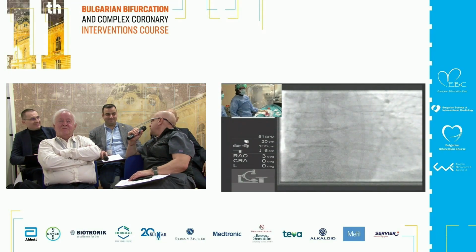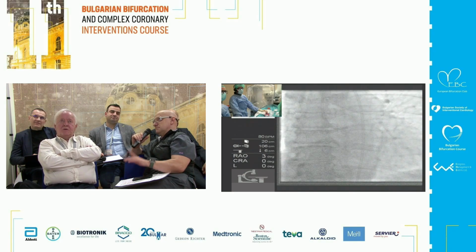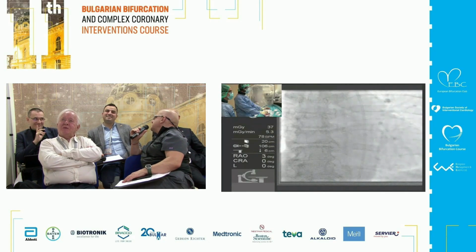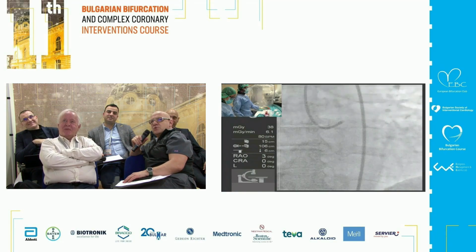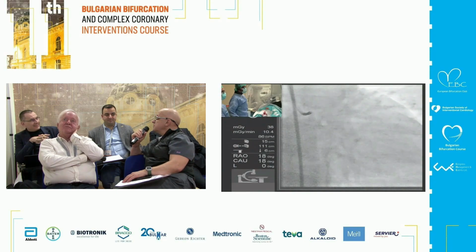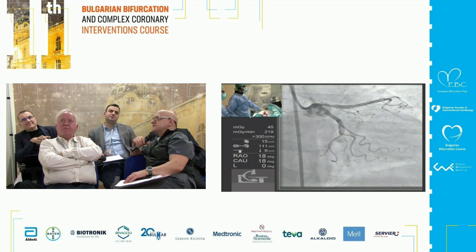Here both options are quite feasible because we don't have a calcified lesion. From the angio, the circumflex is not diseased. What we usually do, especially in my experience, is take a little bit smaller EBU for the left main, just to sit it in front of the left main. Okay.